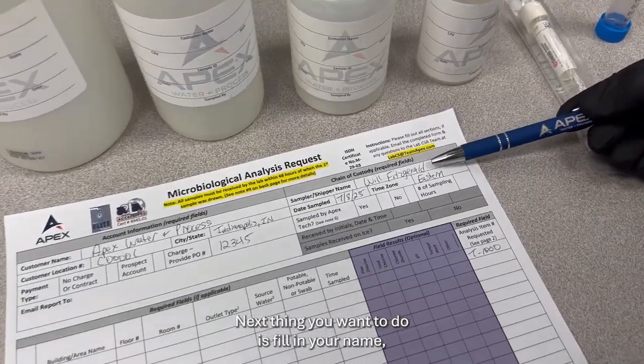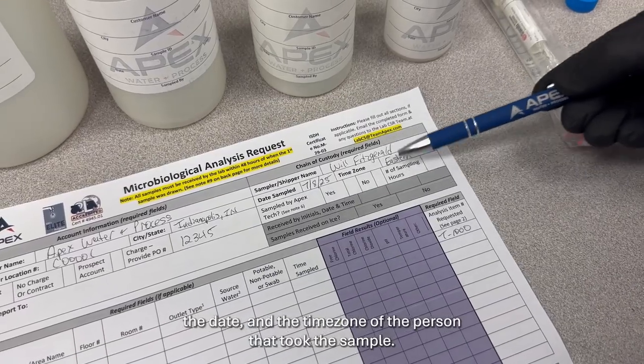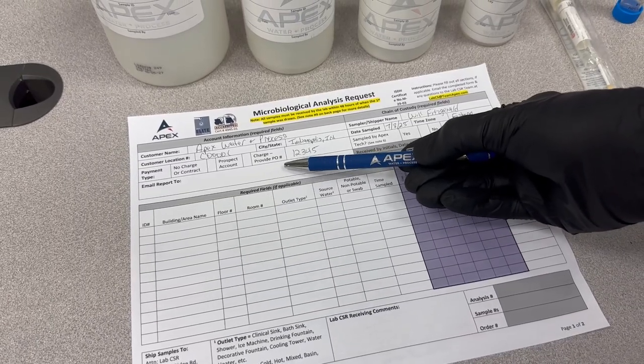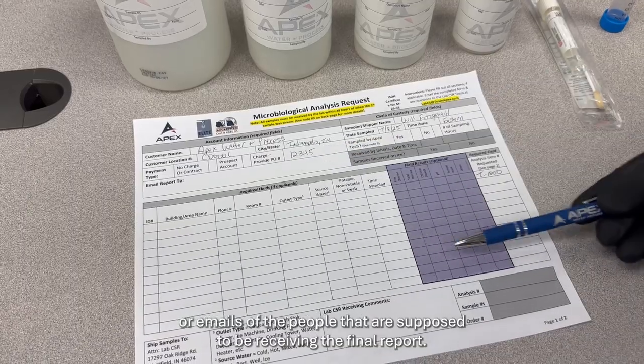Next thing you want to do is fill in your name, the date, and the time zone of the person that took the sample. Lastly, up here in this section, make sure you fill in your email or emails of the people that are supposed to be receiving the final report.